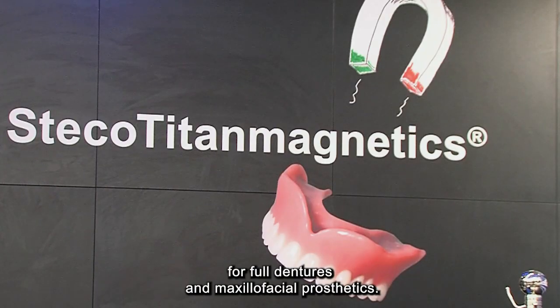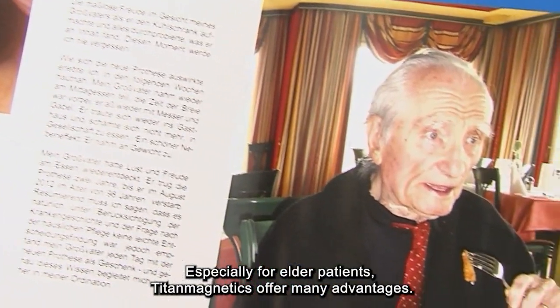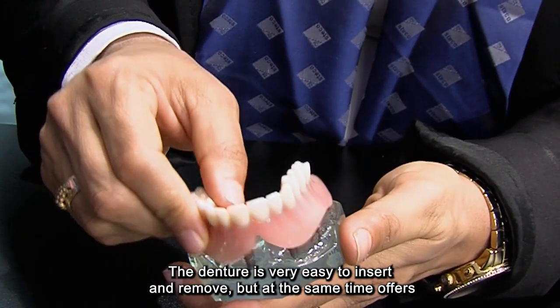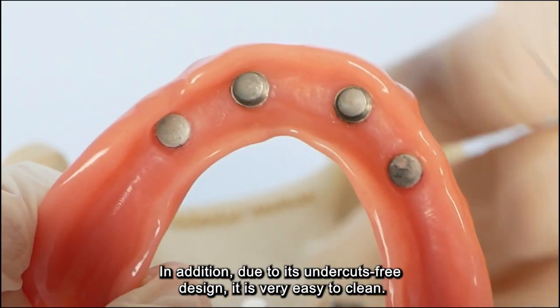Stecotitan Magnetics is a magnetic retention system for full dentures and maxillofacial prosthetics. Especially for elder patients, Titan Magnetics offer many advantages. The denture is very easy to insert and remove, but at the same time offers great stability. In addition, due to its undercut-free design, it is very easy to clean.